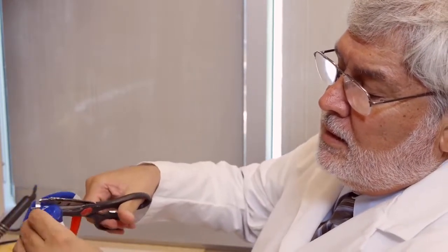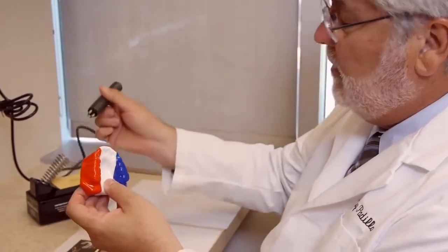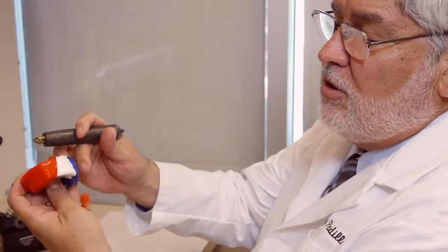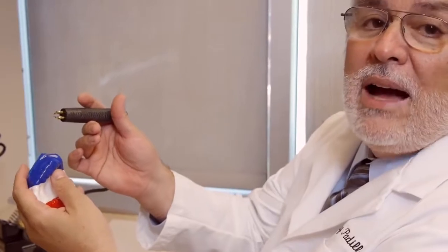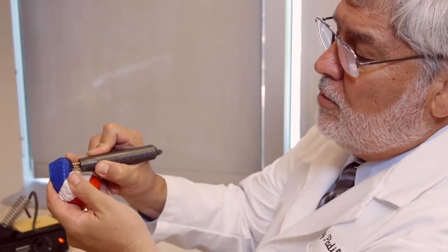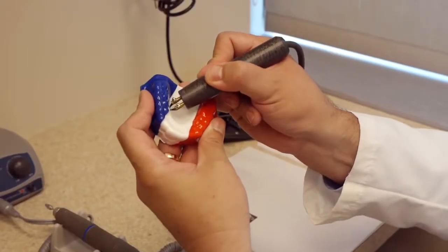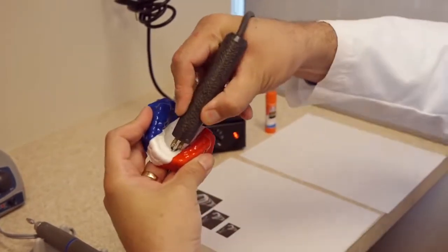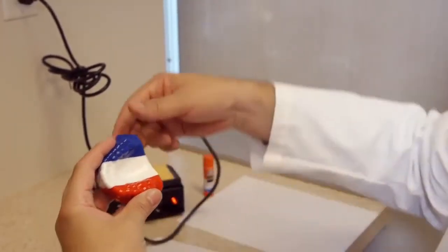Then after we cut it, I'm going to be going to a lab knife, a hot lab knife, and we're going to be trimming off the excess to the highest vestibular borders and to the linguals of the teeth. I usually go back to about the distal of the first molar. So we're going to cut through the distal of the first molar, and we're going to cut lingually around the teeth, and we're going to separate it. It will separate right off.